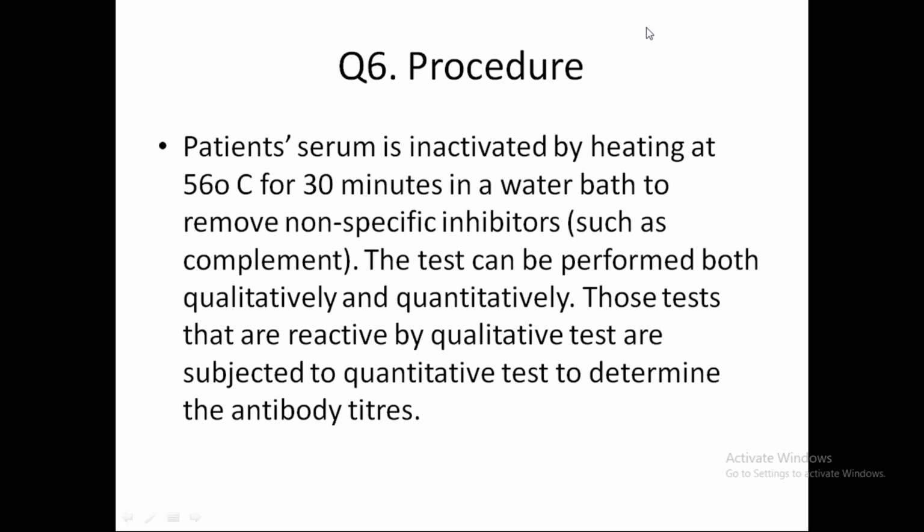This is called qualitative. Qualitative means it only shows whether it is positive or negative. All positive samples have to be retested for quantitative. Quantitative means you have to serially dilute the serum and see at how much titre it is present.